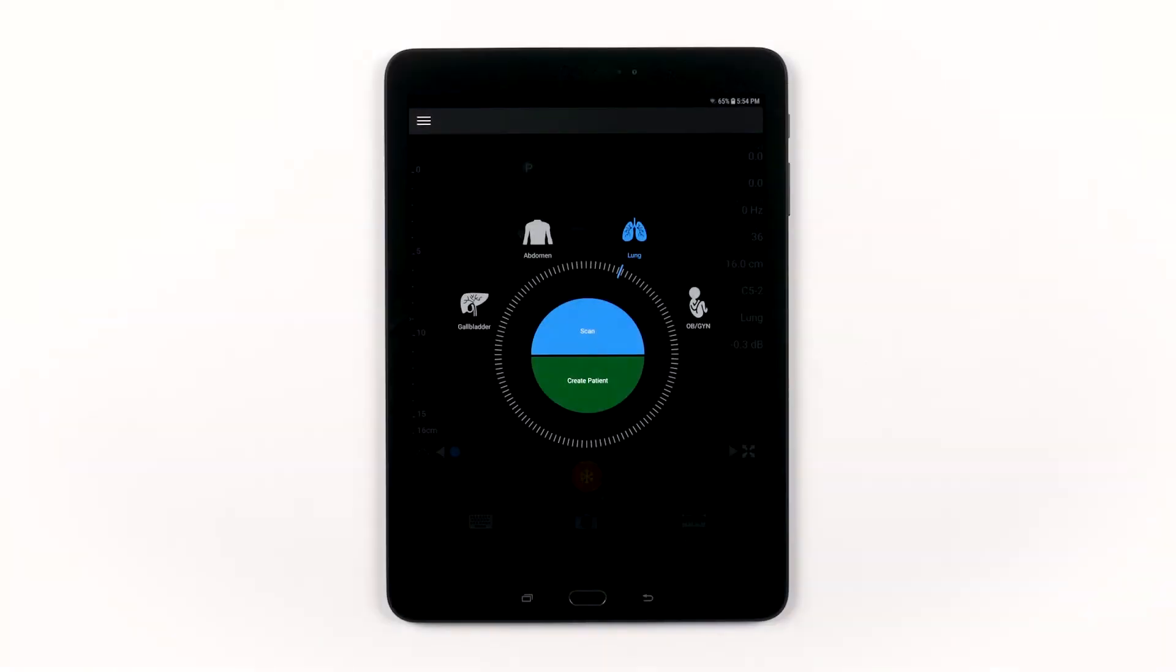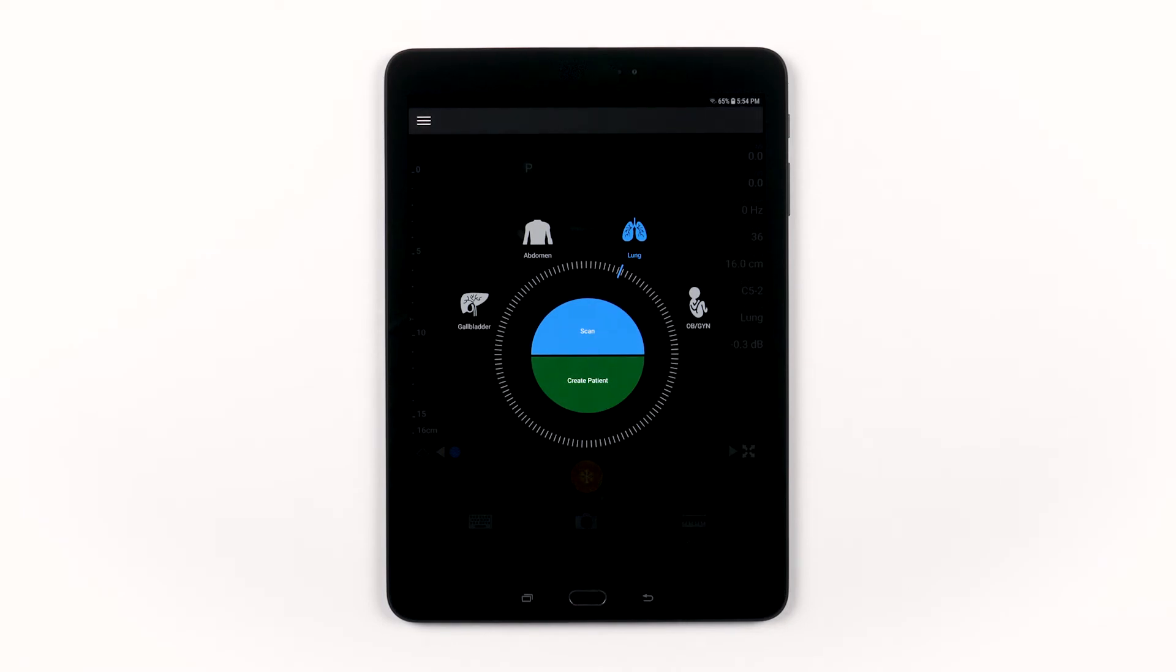In this video, we will go over some tips and tricks to help you get the most out of your Philips Lumify system.